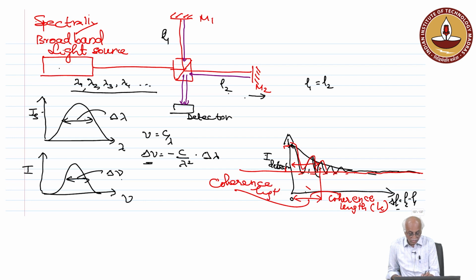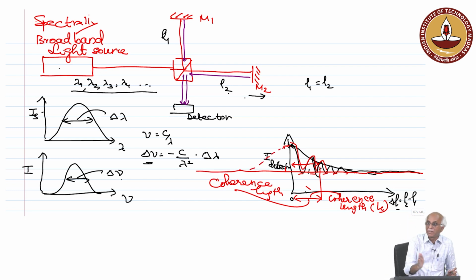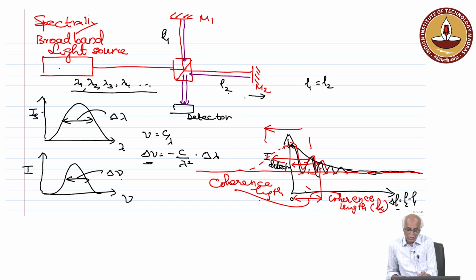this coherence length is of course half of this. Actually, the mirror image is also here; you can move the mirror inside also and still you can see this. Now, this total coherence length is twice this, 2 times Lc. So, let us say this is small lc and the total coherence length, just to distinguish that, is big Lc. Is it fine?